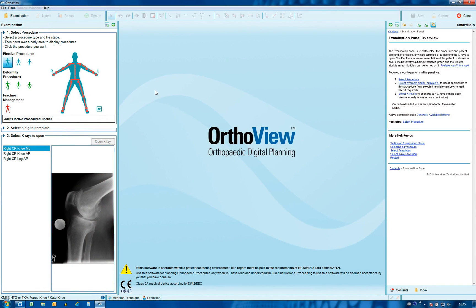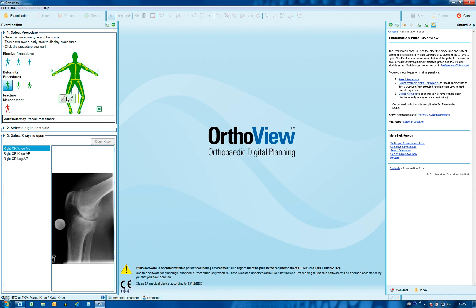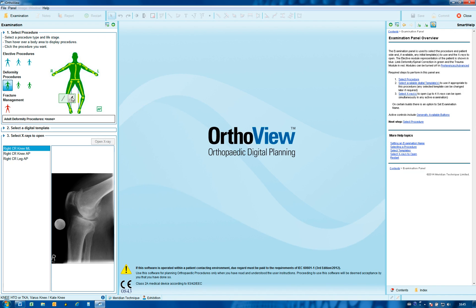In this video tutorial on high tibial osteotomy, we look at planning an osteotomy on a varus lower limb with a single cut in either the tibia or femur. Choose either from the blue knee high tibial osteotomy icon or on the green deformity correction knee for the high tibial osteotomy icon. For more complex cases with multiple cuts, use the lower limb deformity correction planning tool.